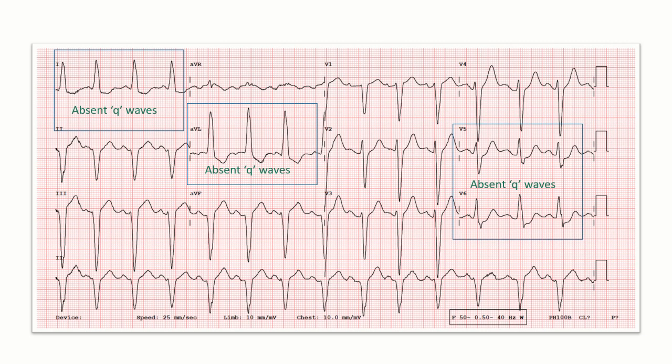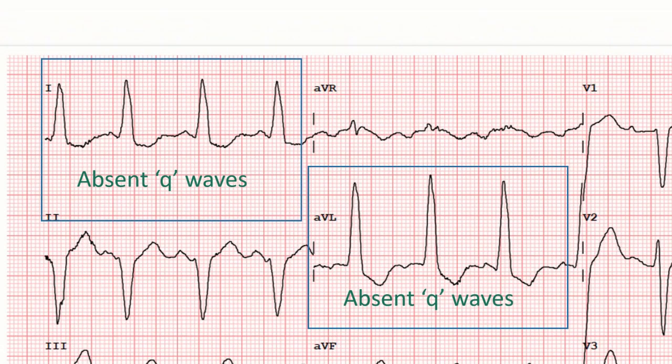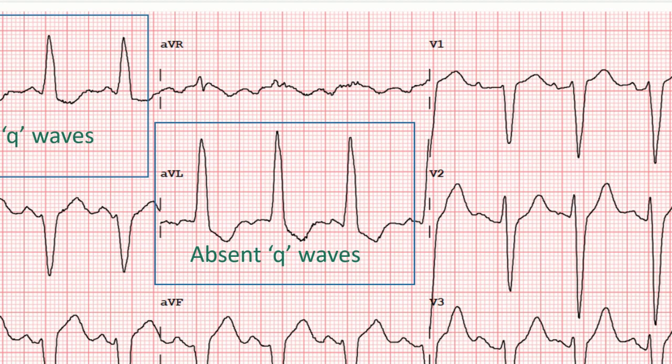Q waves are absent in lateral leads, which are V5, V6, lead I, and aVL. As you can see, there are no Q waves in these leads.